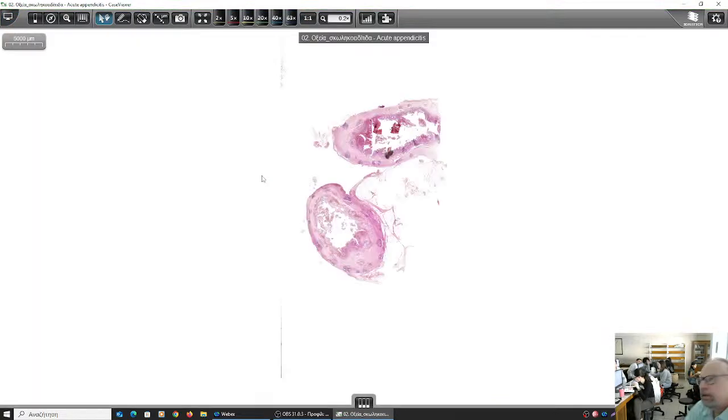Sir, yes, please. It is too clinical, but why did you tell us before that you would choose to do an immunoglobulin test and not just... When you have an infectious agent, you have to look. Why not just CRP, for example? Why not? This is a general marker. Because this could be related to the bacterial infection. The bacterial infection is present. You want to see if the viral infection is also active or if it is not. That's why you look at the immunoglobulins.